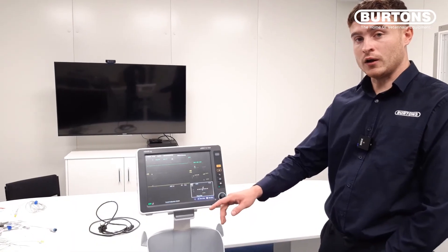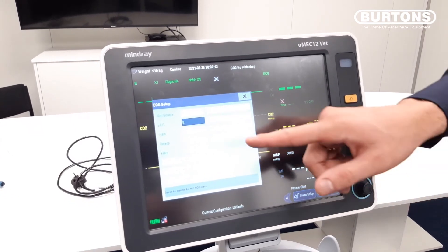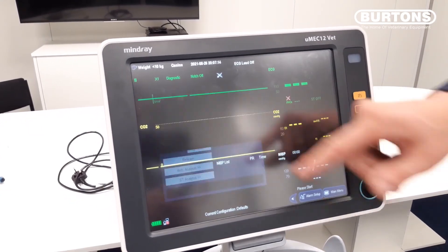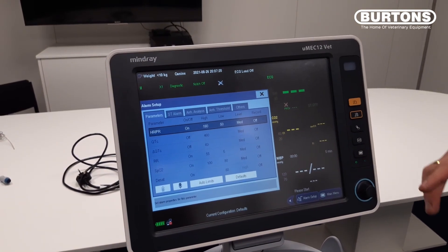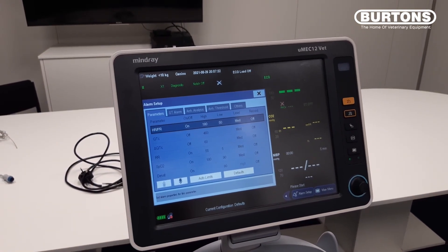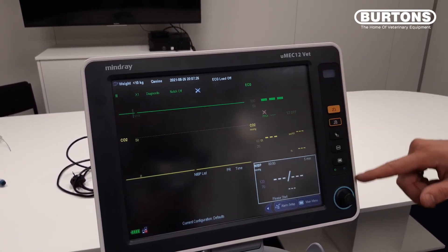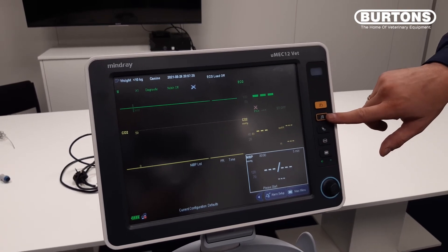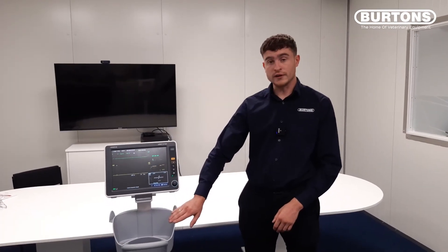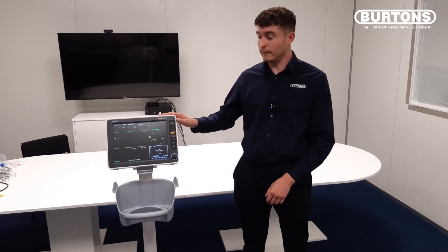To turn off any alarms, we simply tap on the trace and go to alarm setup. On here we can turn most of our alarms off, however we can't turn off any critical alarms. We can silence them by pressing this button here, which will silence your alarms for 120 seconds. It's important to note that the trolley is an optional extra, and if you were to purchase the machine, full in-practice training will be provided.